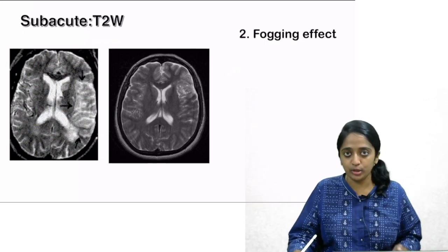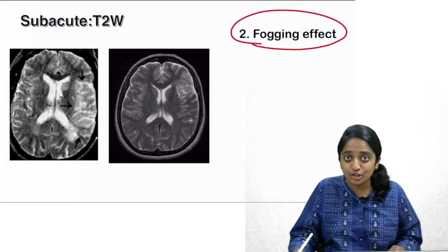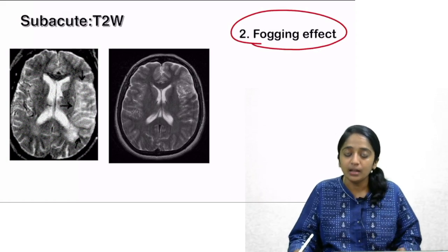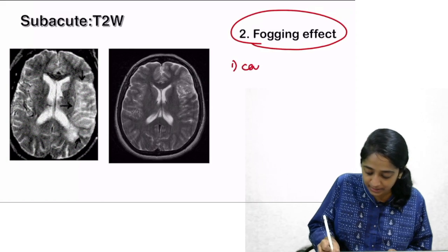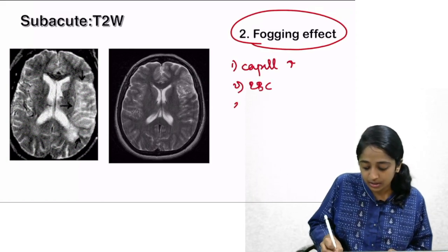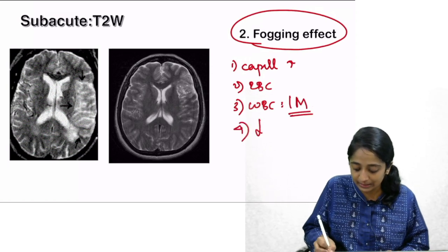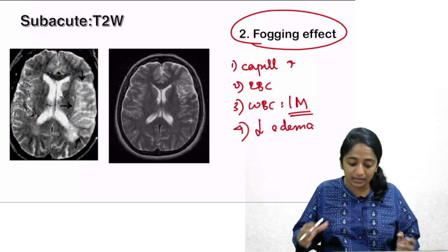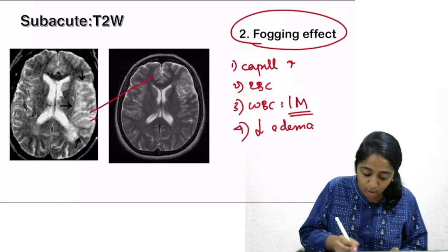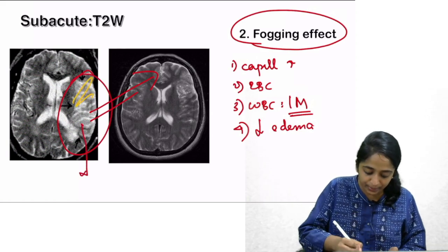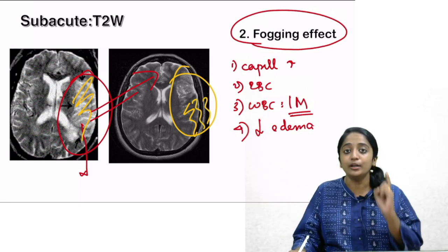Another feature of subacute infarct is the fogging effect, which we also discussed in CT imaging. In the subacute stage, the brain tries to contain the damage by proliferation of capillaries. RBCs and macrophages (lipid-laden) come out, and more importantly, edema decreases. Together, these factors decrease signal intensity, so the T2 signal comes down and the brain looks apparently normal. Initially it was bright, but now there is no significant abnormality apparent on MRI — that is the fogging effect.